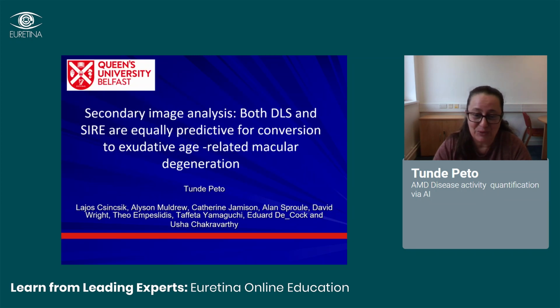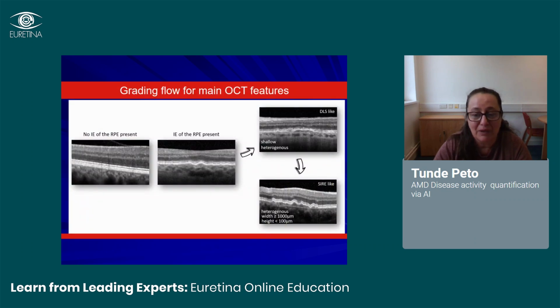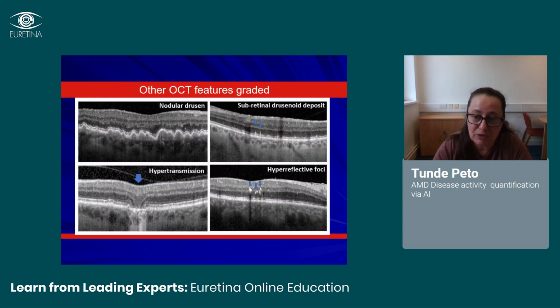And just for those who are really worried about some of us being redundant, I don't think we will be. There is a lot of value in reanalyzing some of the data sets that we have as well, because there's nothing like humans with prior knowledge thinking about grading the features, what features there might be, what you want to teach to the algorithm and what you want the algorithm to notice.